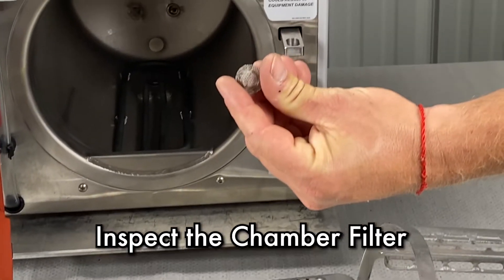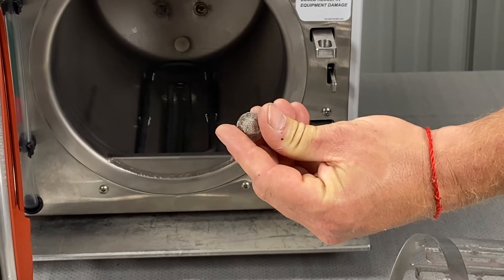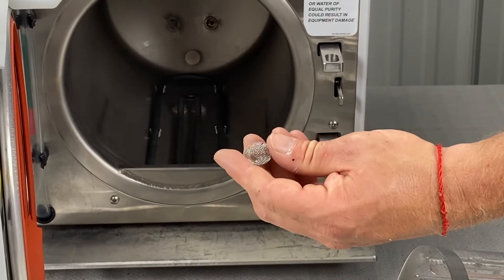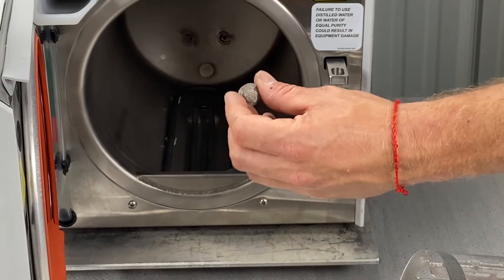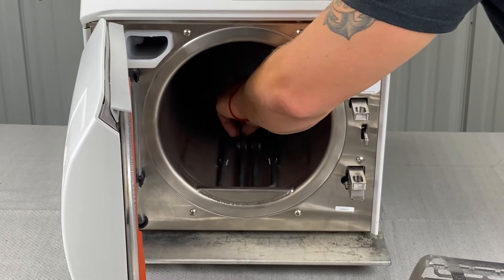You've got this chamber filter here — there are two of them. One's in the center, one's in the back middle to the left. You're going to clean them with speed clean, a toothbrush, and some distilled water, then just pat them as dry as you can, or just rinse them out and put them back. You're good to go.